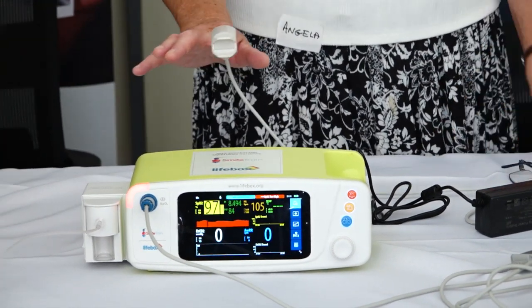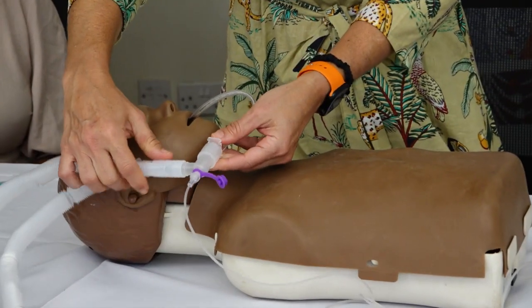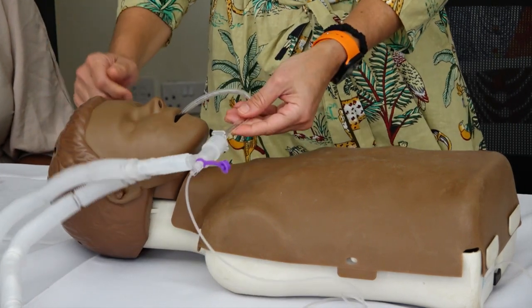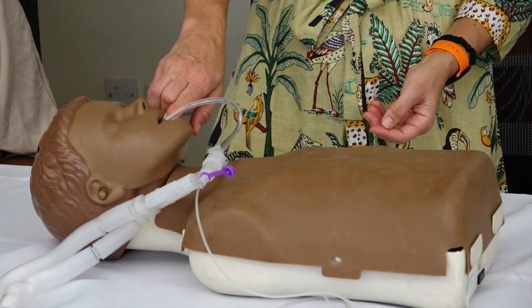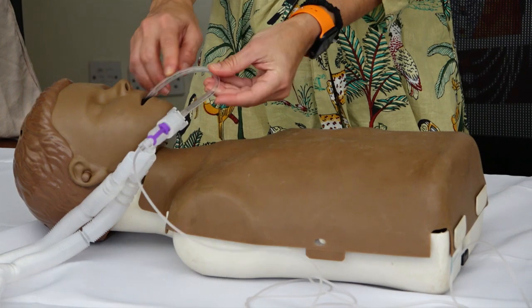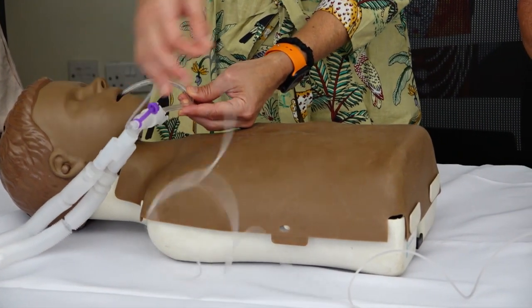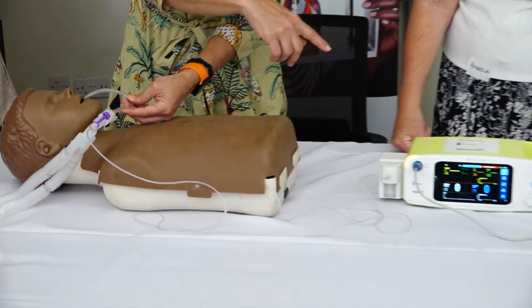So then we put our patient to sleep, and we connect this circuit. You connect this circuit here, and if the tube is in the right place — meaning the airway — then CO2 will be expired by the patient, and then go through this tubing, and it'll sample it, and the machine will monitor or be able to capture that there is carbon dioxide.